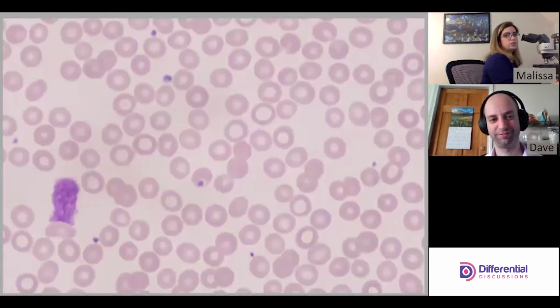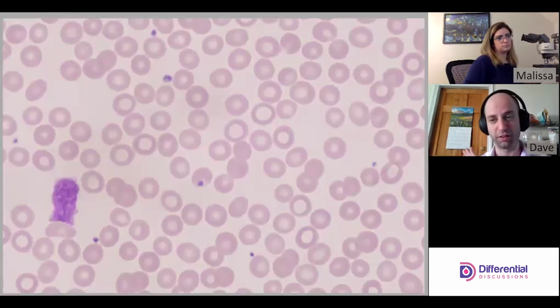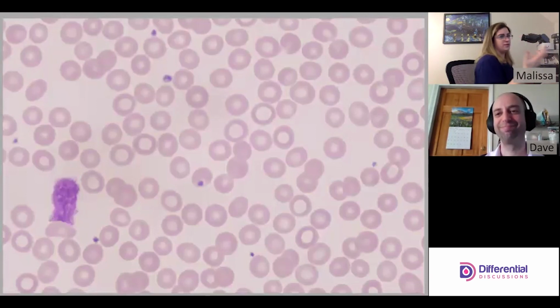You want to see the smudge? Smudge. Very good. This is something you're going to see, and you can't count it reliably. There might be some very edge cases where we count a smudge, but generally speaking, keep moving. Smudges can be important in certain disorders to recognize that they're present, but not one smudge cell. You're going to see one smudge cell on almost every diff you do.